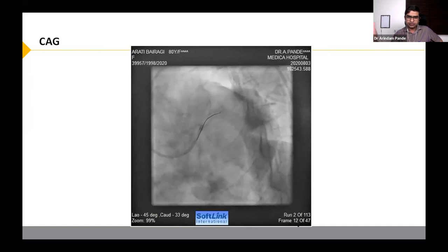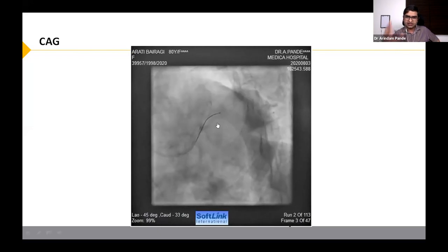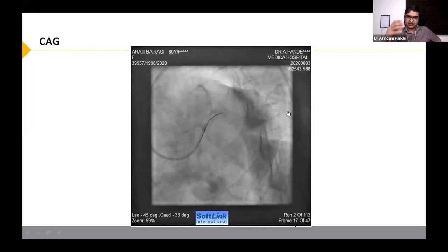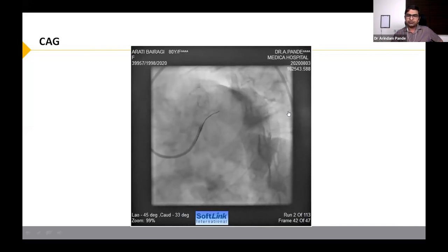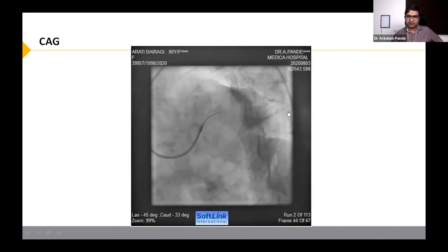So right coronary artery was normal, LCX, there was some moderate lesion, and we can see the left main disease, calcium starting a sort of block of calcium in the left main, distal left main, with whole the LAD, which is extremely calcified vessel. And you can see the lesion, it's very tight, the LAD proximal portion. So first difficulty in this case, as I already mentioned, patients, relatives, everybody were counseled and they agreed for angioplasty only. So bypass was not an option.